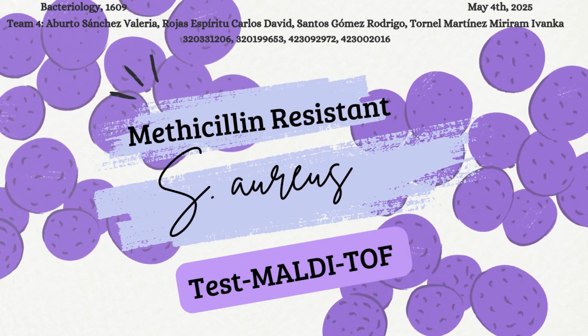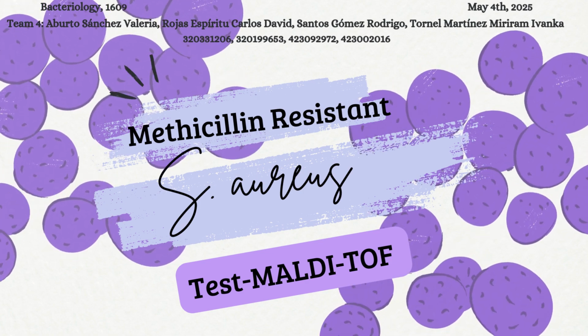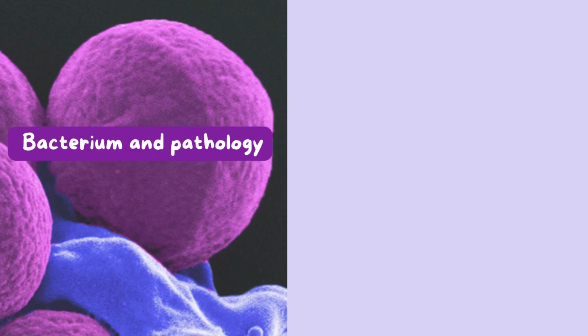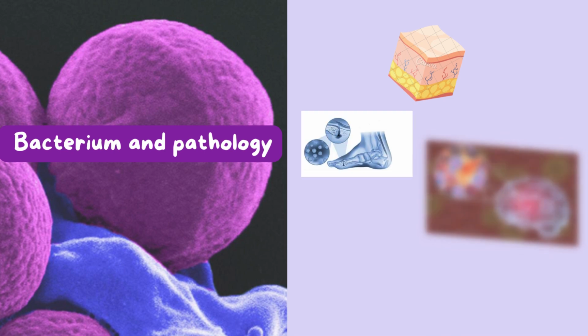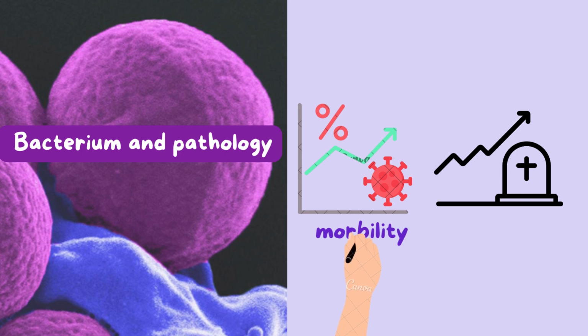In this video, we'll explain the microscopic characteristics of MRSA, the pathology it causes, and how MALDI-TOF mass spectrometry enables rapid detection. Methicillin-resistant Staphylococcus aureus, or MRSA, is a major threat in healthcare settings. It frequently causes skin and subcutaneous tissue infections, followed by invasive infections like osteomyelitis, meningitis, pneumonia, lung abscess, and infective endocarditis, and is associated with increased morbidity and mortality compared to any other organism.